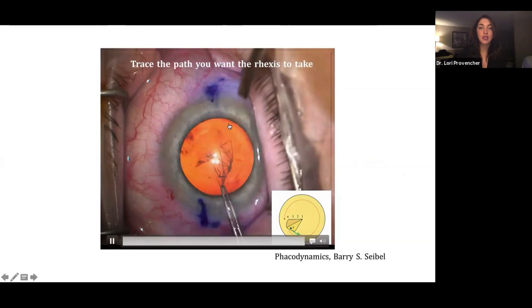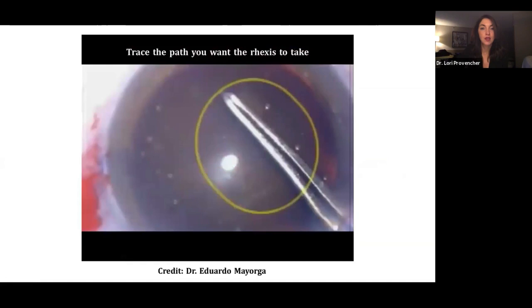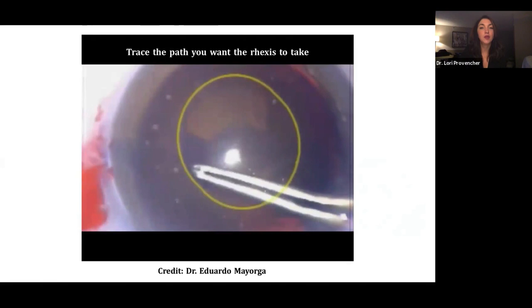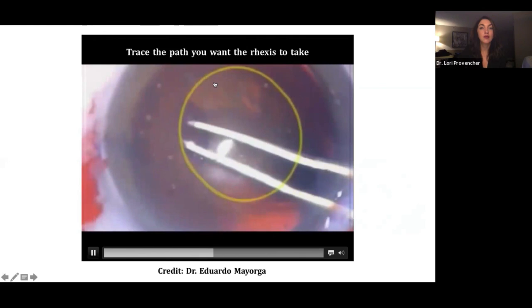It's really easy, I think, to get focused right at the crotch of the tear. And then you lose sight of where your utratas are going. And then later on, when the tear catches up to the utratas, your rexis has gone somewhere you don't want it to go. This is another example that I borrowed from Eduardo Mayorga. And this is a nice view with trypan blue, but you can see he's put a yellow circle here for you. You can see that the utrata tips are going here, tracing the path you want the rexis to take. And the rexis follows nicely.